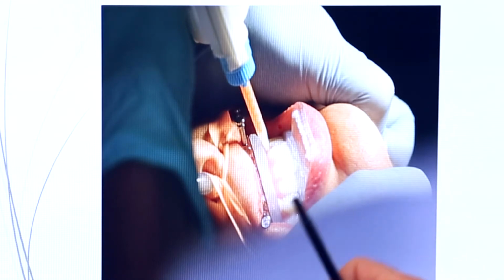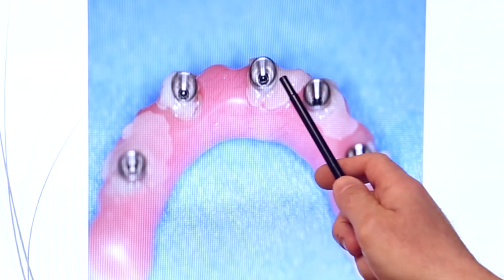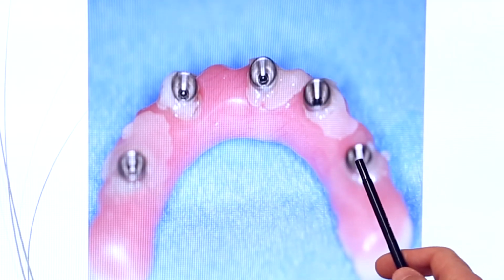So this picture is showing the attachment of the brand new teeth to the transfer copings while the patient is biting down to ensure proper positioning of the bridge. This is a view of the brand new prosthesis from the underside, again showing us the transfer copings which were attached to the implants but now are unscrewed from the implants once the attachment process has been completed.